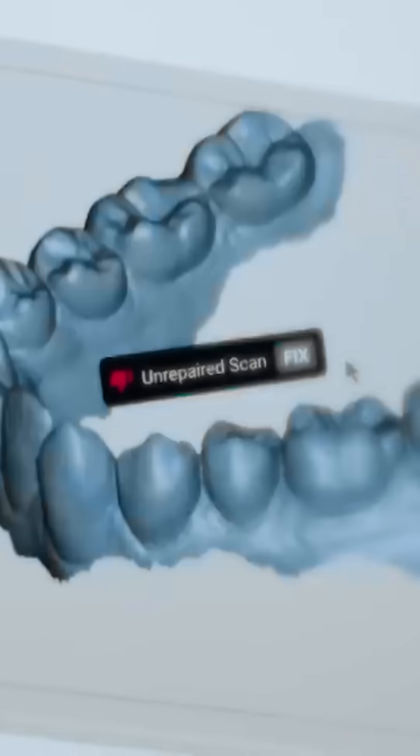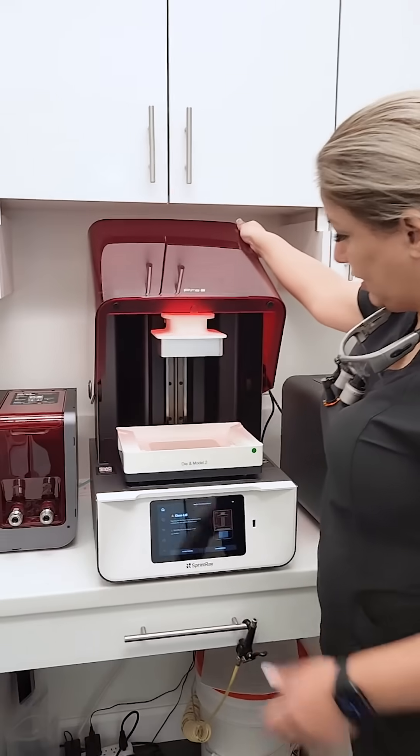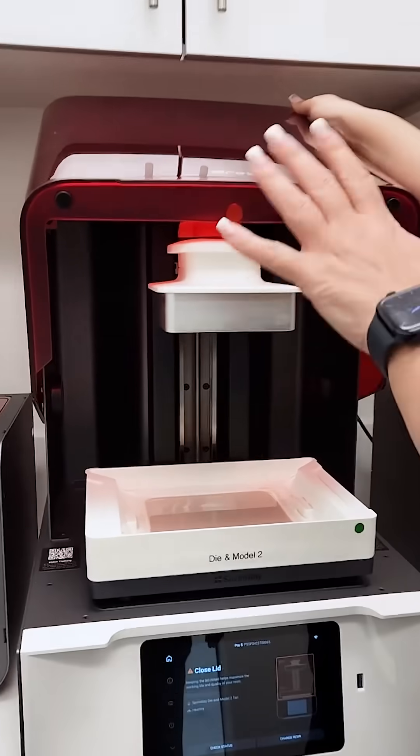It's a 3D printer, which is such a great technology — it prints it for us. Let's go back so I can show you how we print it. This is our 3D printer, and basically the software sends a message here to print the models.